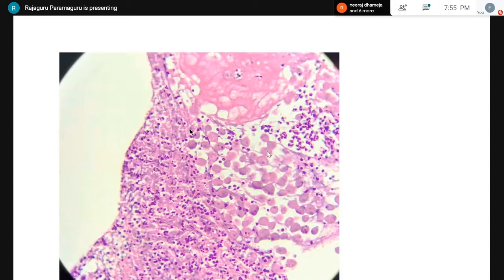Clinically, endoscopically, they may have missed it because the patient was having a rectal ulcer. But if we know that it can present and look like an IBD with some chronic features like distortion and basal plasmacytosis, we can pick these up. So we'll have to keep amoebiasis in mind also.